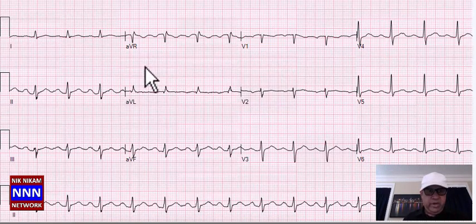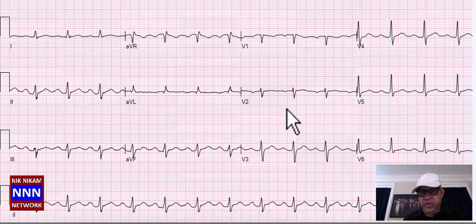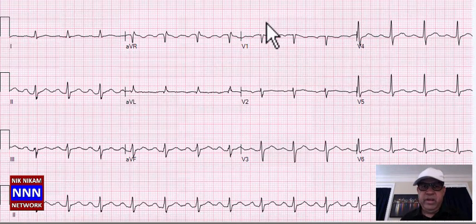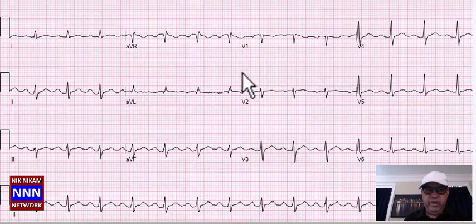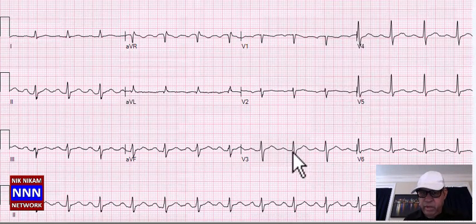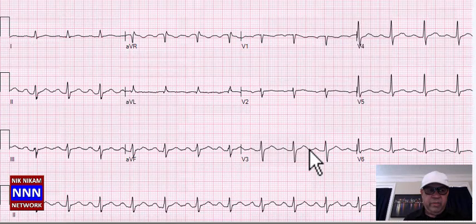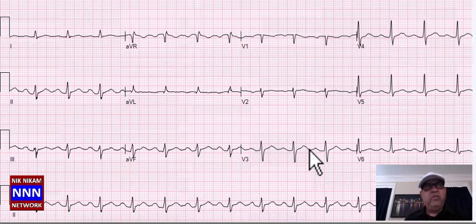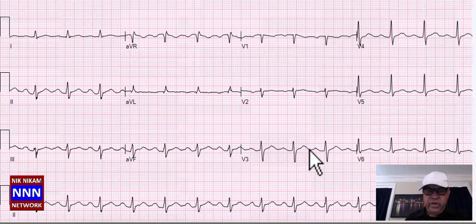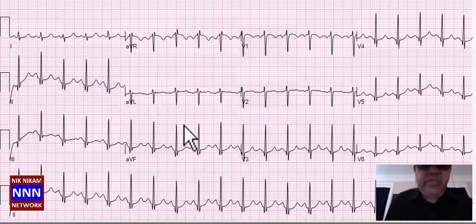We have a sinus rhythm here. It doesn't quite meet criteria for left axis deviation. On the chest leads some non-specific T-wave changes. The computer reads a prolonged QT interval of 469 milliseconds. The QT interval is measured from the beginning of the QRS complex to the end of the T-wave, corrected to heart rate. Patients on anti-arrhythmic drugs and some anti-psychotic drugs can have a prolonged QT interval, which could be a precursor for ventricular arrhythmia and ventricular tachycardia — very important to pay attention to.